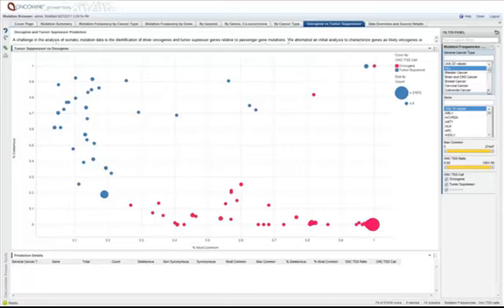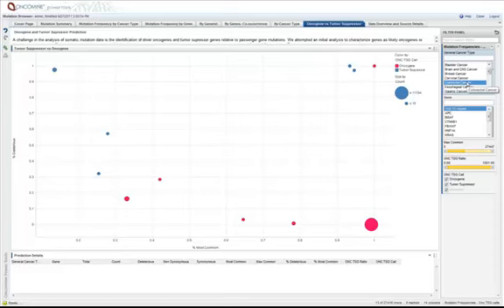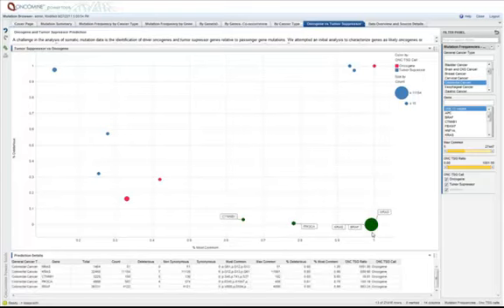So for example, if I click on colorectal cancer, now we're summarizing only mutation data from colorectal cancers and asking which genes show recurrent hotspot mutations at particular amino acids in colorectal cancer. And because we don't have large collections of colorectal next-gen sequencing studies yet in the database, you can see that it's a relatively small number of predicted oncogenes in colorectal cancer, well-known genes. But we expect that views and analyses like this will become more rich as we bring in more sequencing data.